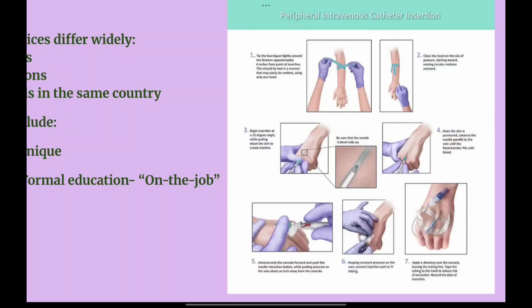After the vein is selected, you see to it that the needle is showing its bevel upside. That is, the pointing side should be towards the vein and the open bore should be towards your side, facing upwards. Once the bevel up is taken and the vein is selected, you have to go with one swift, smooth motion.